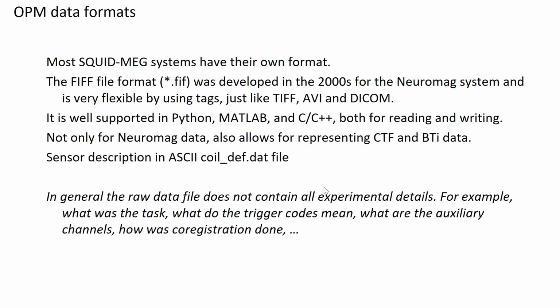Again, moving further towards the analysis. OPM data, of course, gets stored on a computer, and we need to read it in our analysis software. Most SQUID-based MEG systems have their own format, and since we are so common to them, those formats are well supported in all the toolboxes. The FIFF file format was developed in the 2000s for the Neuromag system, and is very flexible in using tags, just like the TIFF or the AVI or the DICOM format. And that's a well-supported format for Python, MATLAB, and C++, both for reading and writing. Although it's not a perfect format, I consider it the best format that we have right now in moving forward with OPM system development.